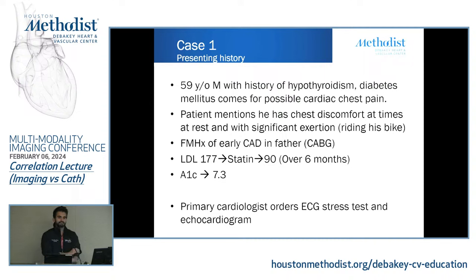Okay, so good afternoon, everyone. I have some interesting cases where I'm going to shift from PET. I'll go back to PET, but I'll start initially with CT. We have a 59-year-old male with a history of hypothyroidism and diabetes who comes to the clinic for possible cardiac pain. He says he's been having some discomfort, sometimes at rest, but mainly when he really exerts himself, like riding his bike.